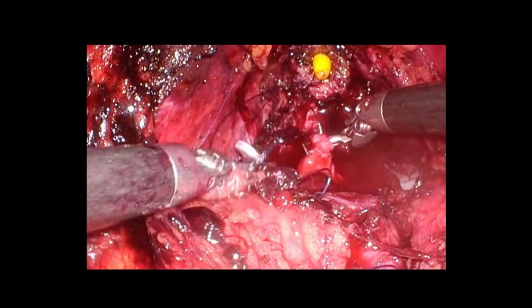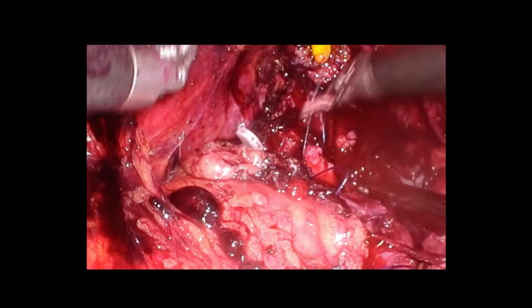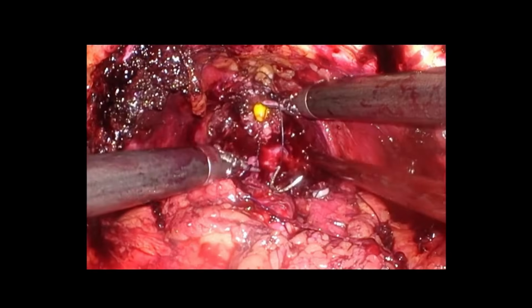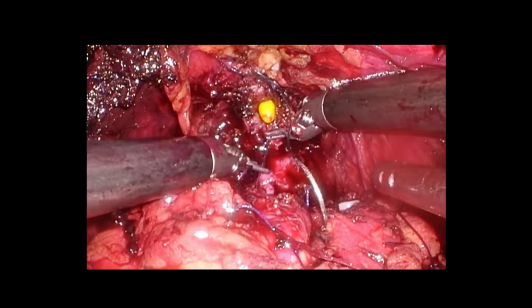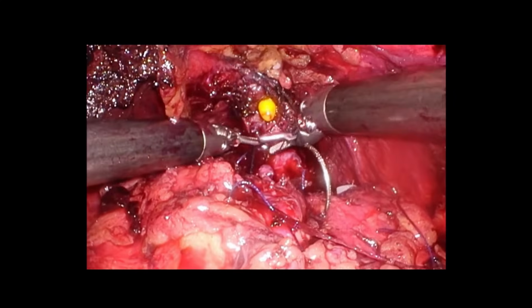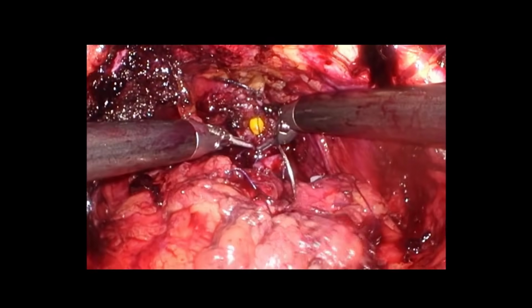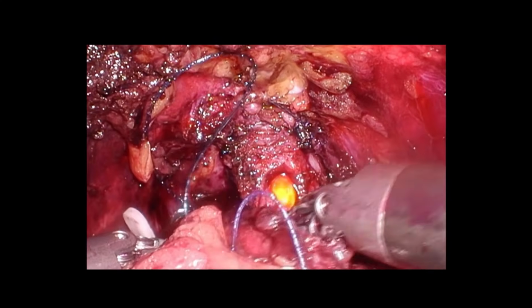Once you take the Rocco stitch, make sure that you don't pull it initially, but a gentle controlled traction of the anastomosis gives a good approximation, so that the subsequent mucosa to mucosa of the urethra and the bladder neck becomes easy.